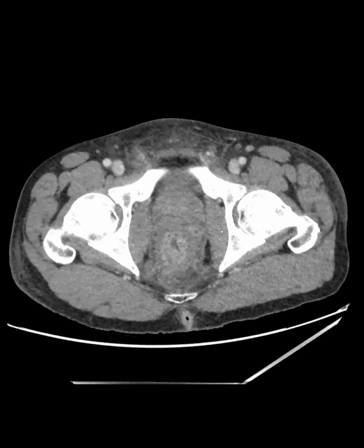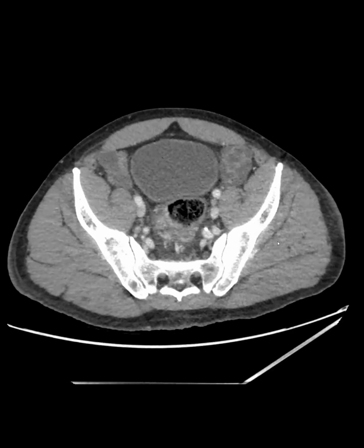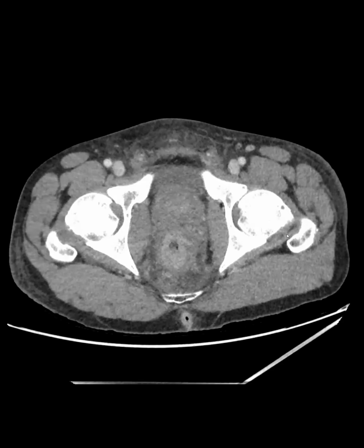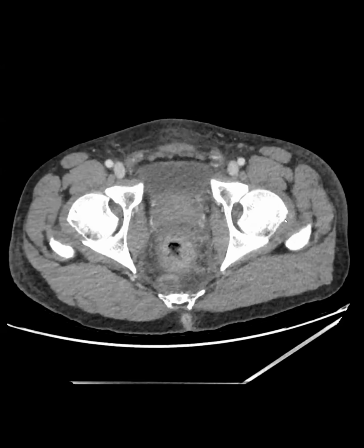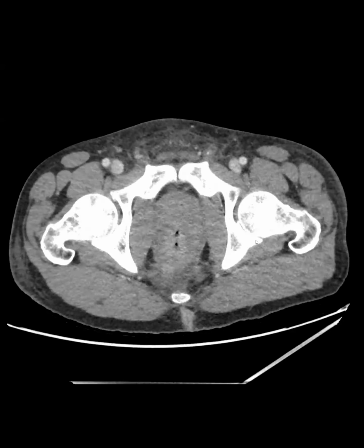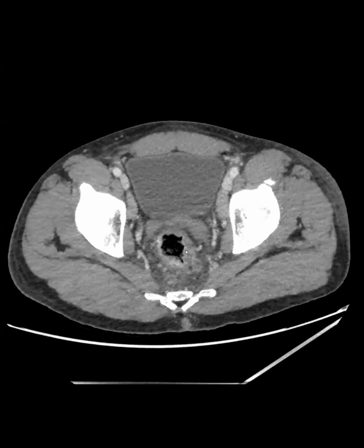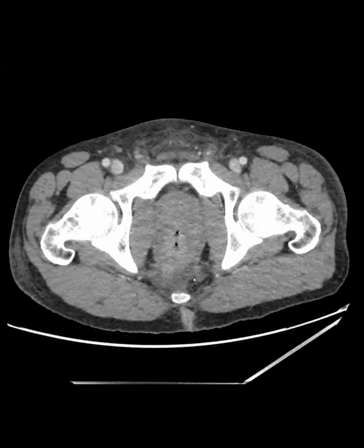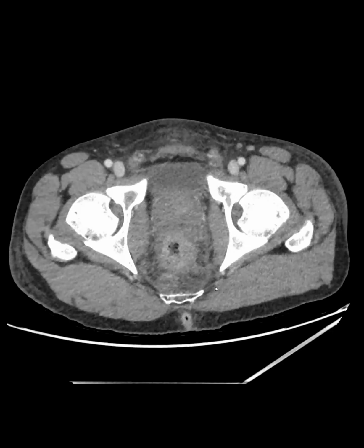So I was reading this and I was like, okay, this is severe proctitis. This could be due to any number of infections, including crypto or HSV, lots of different things. And then we looked into the chart and we found out that this was an HIV positive male patient who recently had a sexual encounter with another male, and that other person tested positive for monkeypox.